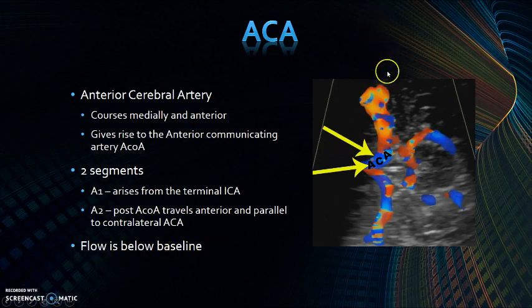So if you're scanning here, you have your transducer here in this part of the head. Your sound beam is coming here. This flow is going towards the transducer, so it's going to be above baseline. This flow is going away from the transducer, so it's going to be below baseline.